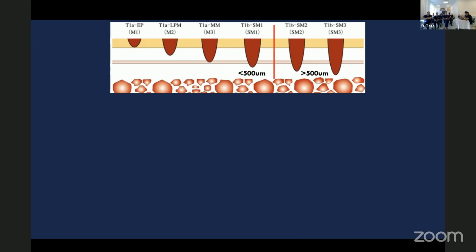One of the big advantages of endoscopic resection is not just the fact the patient can get treated by it, but it's also, it can give a microscopic diagnosis of the problem and the need for further therapy, the risk of lymph node metastases, the need for extra surgery or extra chemotherapy. Other treatments can be determined by endoscopic resection.